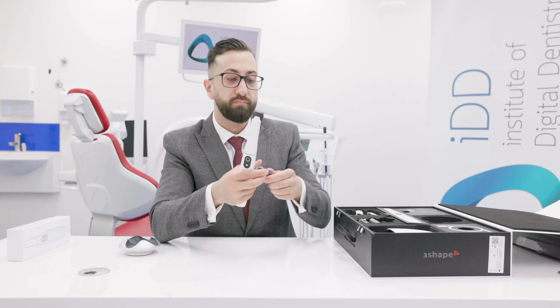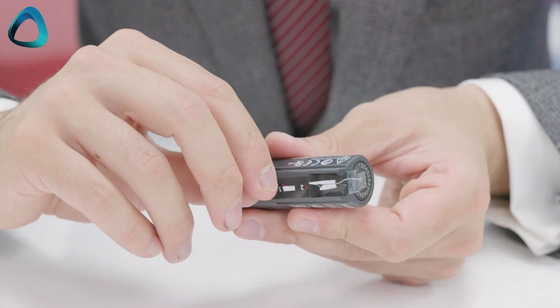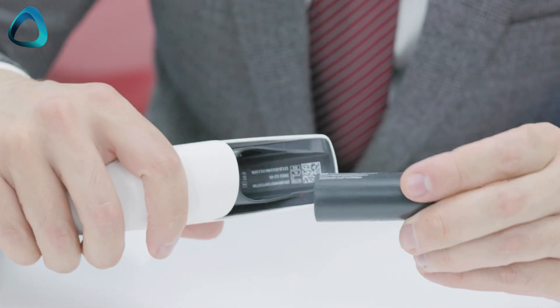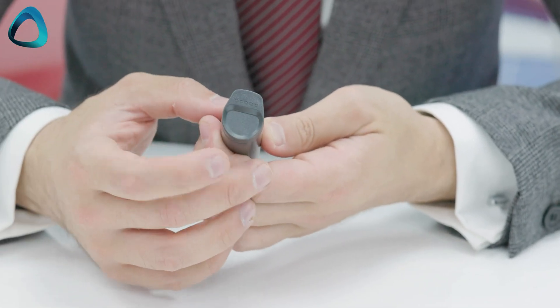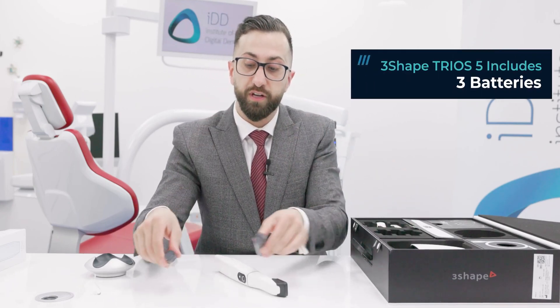Here we have the new Trios 5 batteries. Just like the Trios 4, there's a little tag you rip off to expose the metal contacts, and the battery fits into the back of the scanner. A couple of cool things about these batteries: there are indicator marks on the end, and when charged, you can tap the back to see how much battery life remains without having to turn everything on. The company gives you three batteries included with the Trios 5.